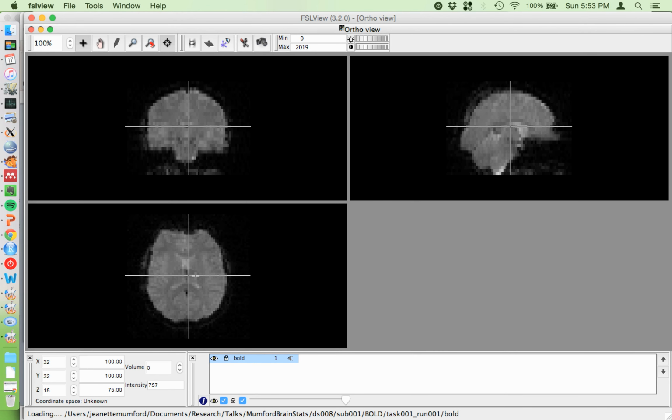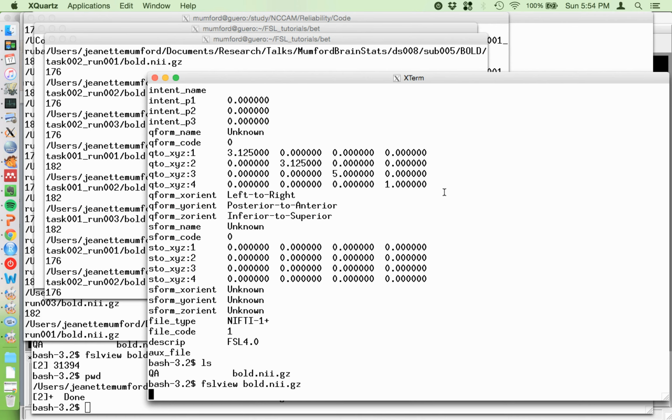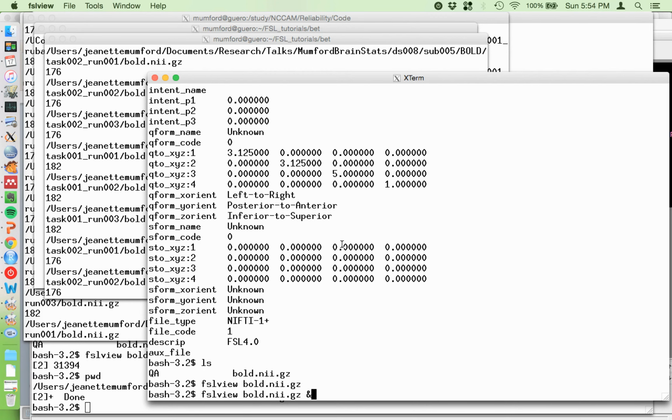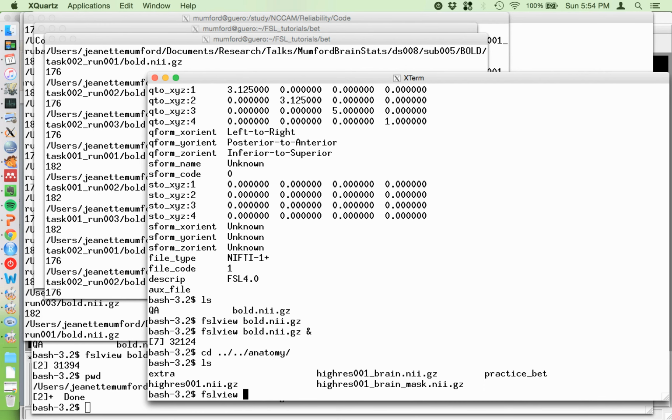The first thing you want to check, and this isn't showing up for this image, and that's fine, is that we should be seeing labels. Let me give you a different data set. No, of course, the one time I forget the ampersand. Okay. Oops, I've already run some. You won't have these files. I've already run a little bit of the brain extraction stuff. That'll be next time.